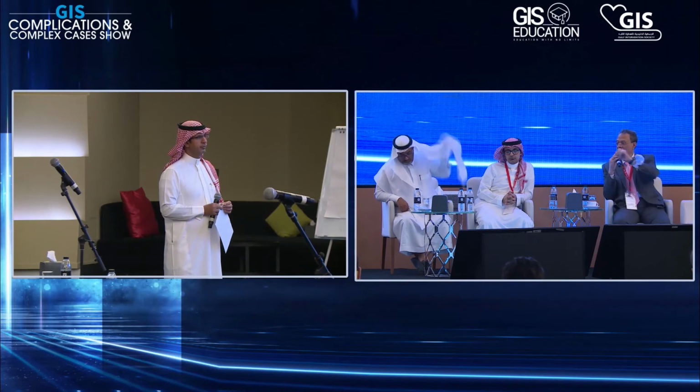If the size of the vessel is big, you can crush it. If the size of the vessel is not big, you can push it distally into one of the branches, as we saw. This is very important because sometimes you cannot snare, and sometimes you destroy a lot of things to get it back. Also, the multi-wire technique is a good option.